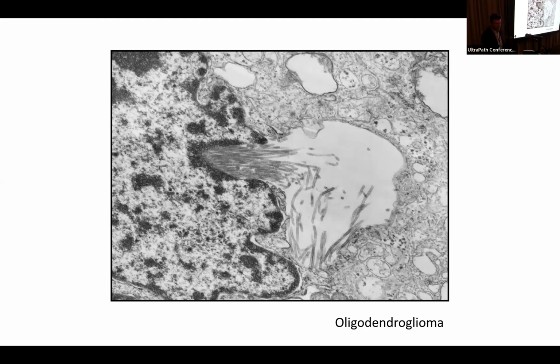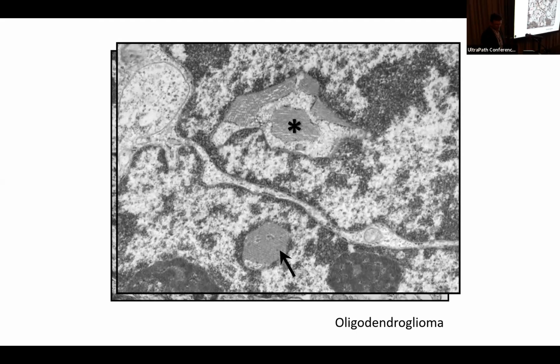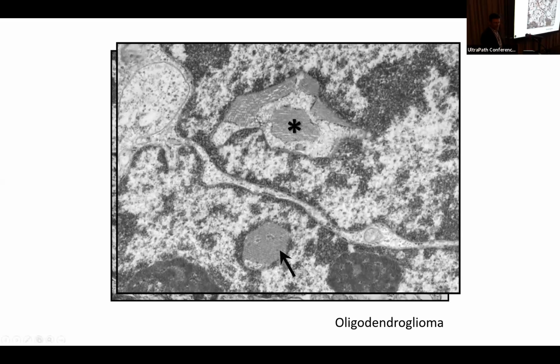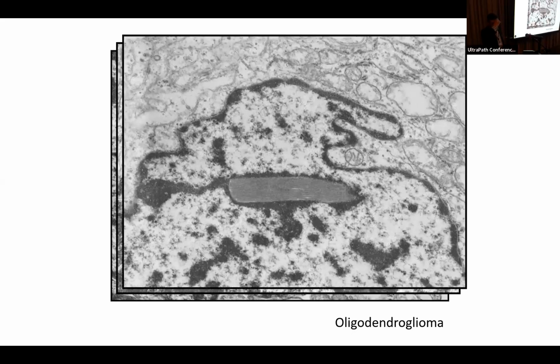So we'll start off here. Here you can see the cytoplasmic microtubules, and they're deforming the nucleus. And then in a bit farther along in the process, from more of a cross-sectional plane of view, you can see that these tubular masses have now been condensed into a kind of paracrystalline structure, but still remain.